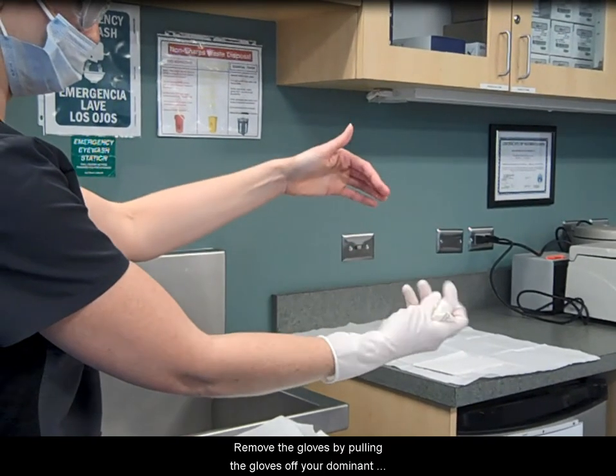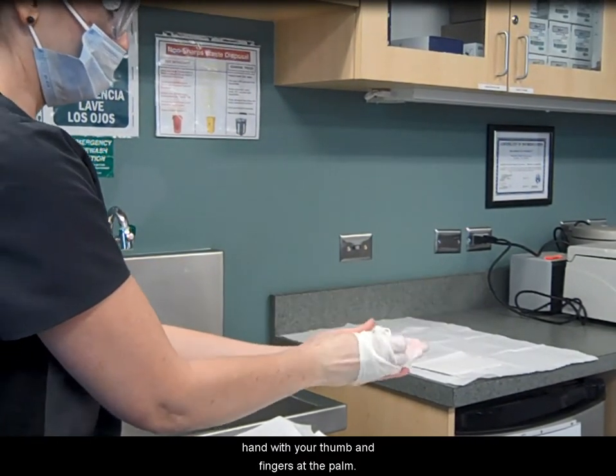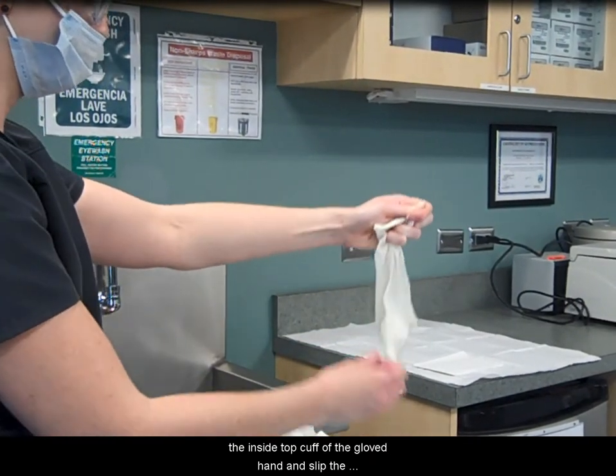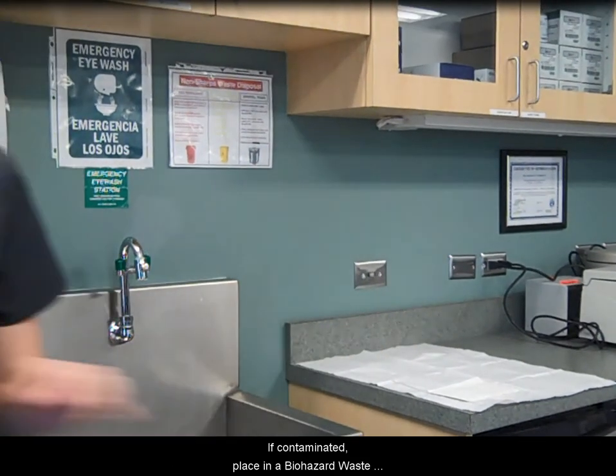Remove the gloves by pulling the gloves off your dominant hand with your thumb and fingers at the palm. Pull the gloves off inside out. Slip your ungloved hand into the inside top cuff of the gloved hand and slip the glove off inside out. If contaminated, place in a biohazard waste bag and wash hands.